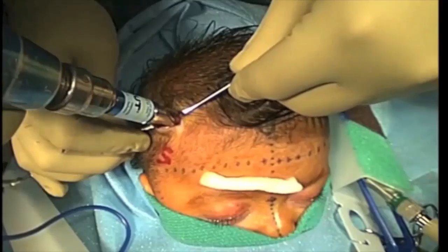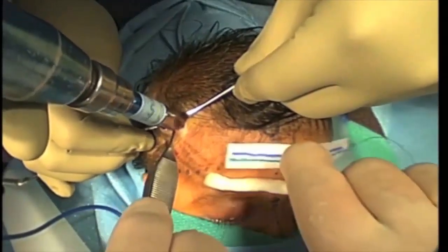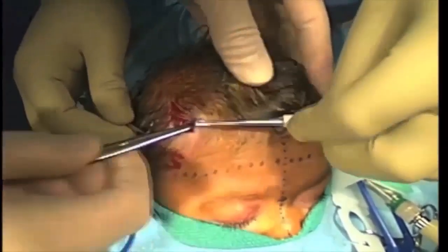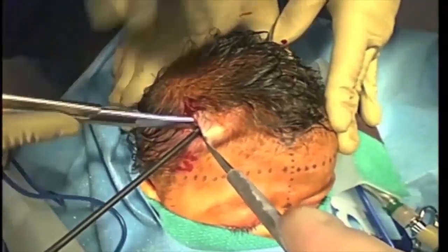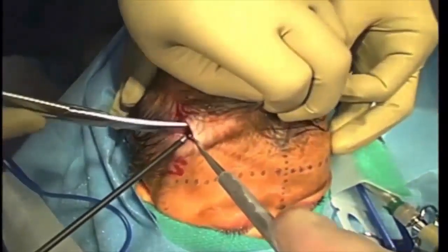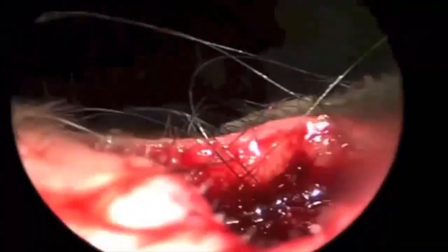A single small burr hole is made with a pediatric craniotome at the incision site as demonstrated. The epidural plane is carefully developed with the aid of a number 1 Penfield dissector to reach the anterior fontanelle as shown here. The osteotomy can be made with bone cutting scissors or bone cutting rongeurs. A 30-degree rigid endoscope is used to visualize the epidural plane before and after the osteotomy as shown here. The parietal bone has been fully freed from the frontal bone.